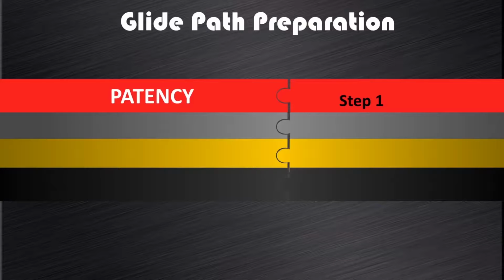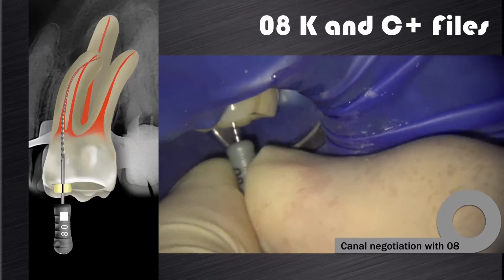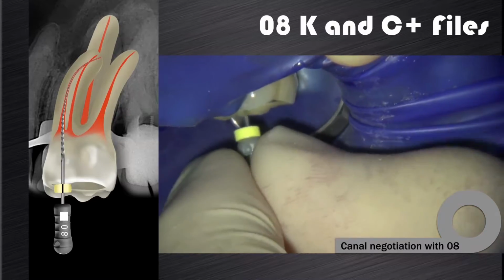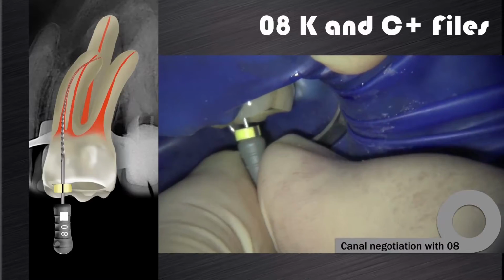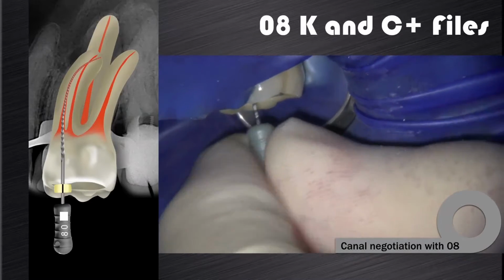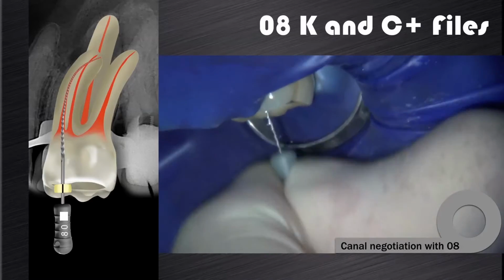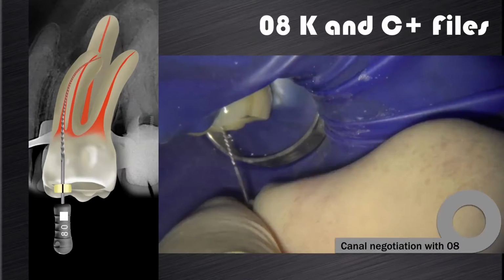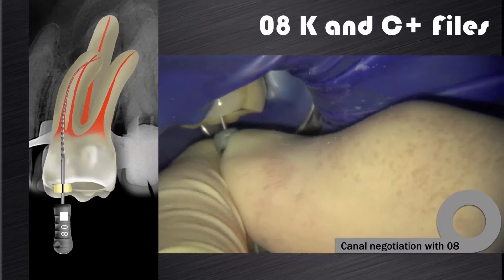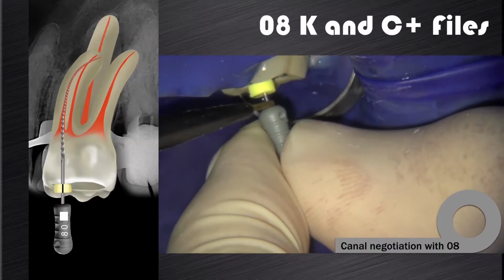As mentioned before, canal patency is the first step. I use a combination of 08C+ and 08K files to negotiate the canals to patency. Some cases are easy and some cases are very difficult. I think that the inability to create patency to full working length is often the reason why we see so many poorly prepared and obturated root canal systems. In this video clip you can see that I've just achieved patency now. After that I will do my working length using an electronic apex locator.